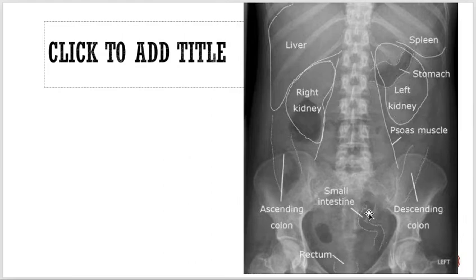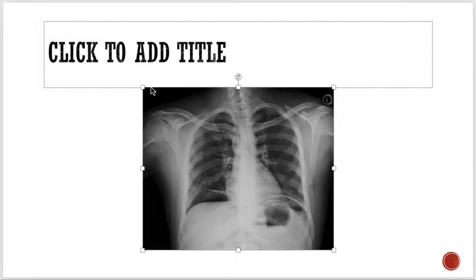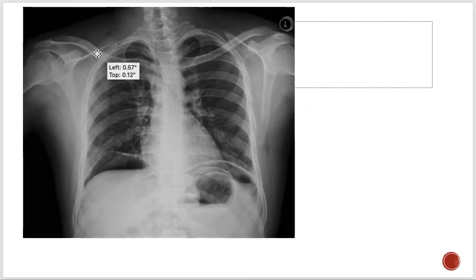So now gas inside abdomen is completely fine, but now I will show you something called extraluminal gas. So intraluminal, like within the lumen. So of course, when there is extraluminal gas, that's where the problem arises. Now I will show you one X-ray. Okay. First of all, see, this X-ray is which one? Abdominal or chest? This is a chest X-ray, right?